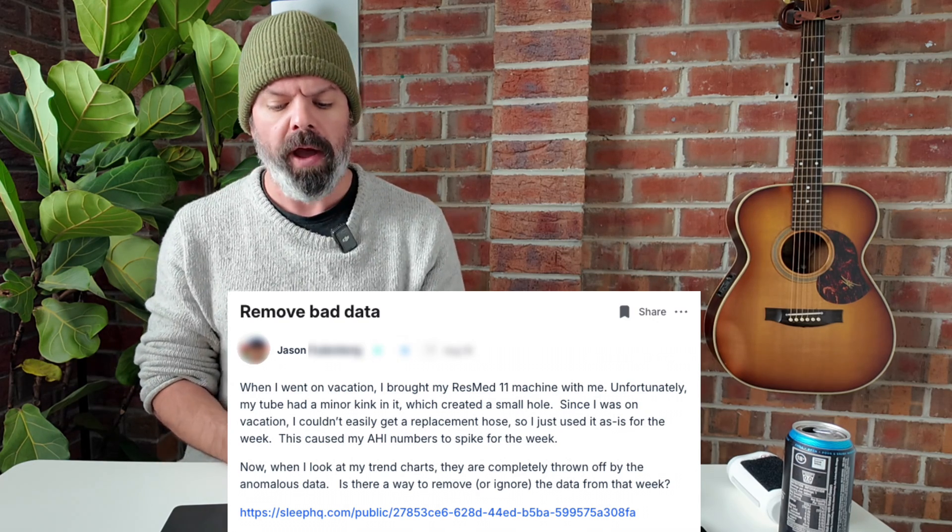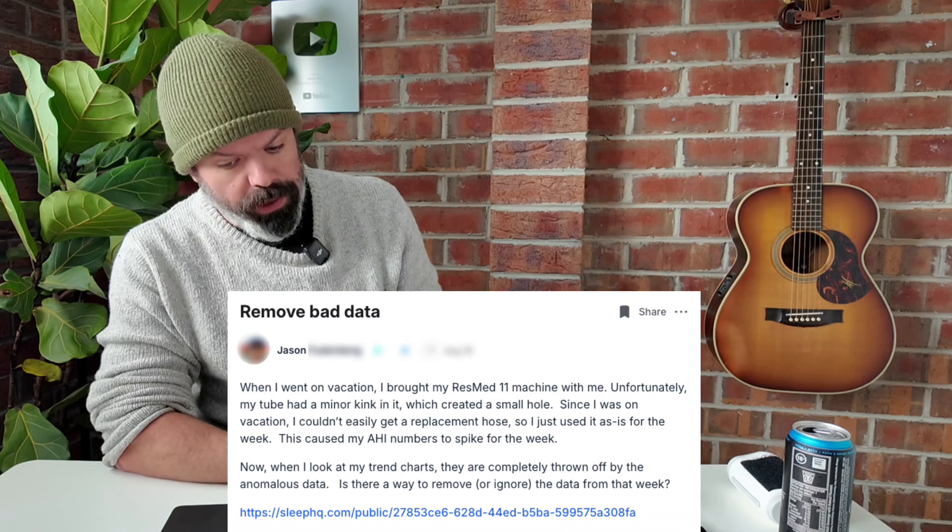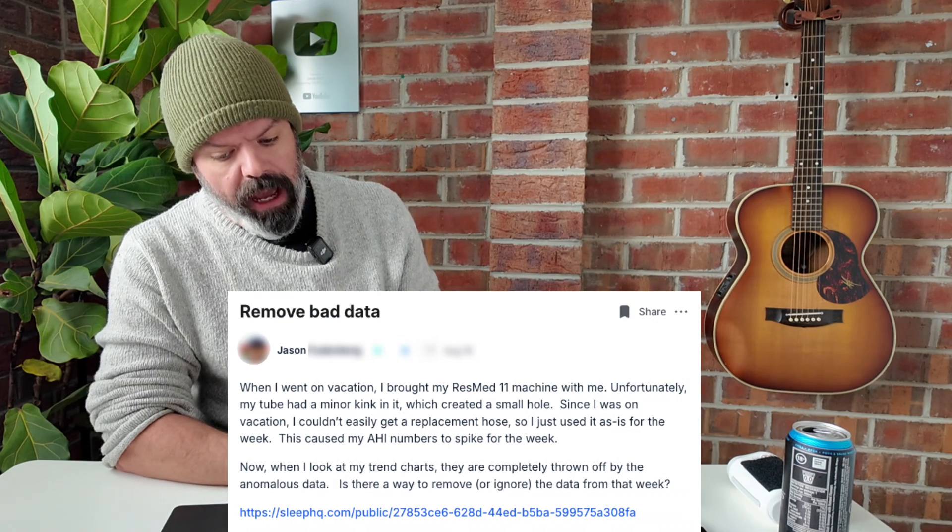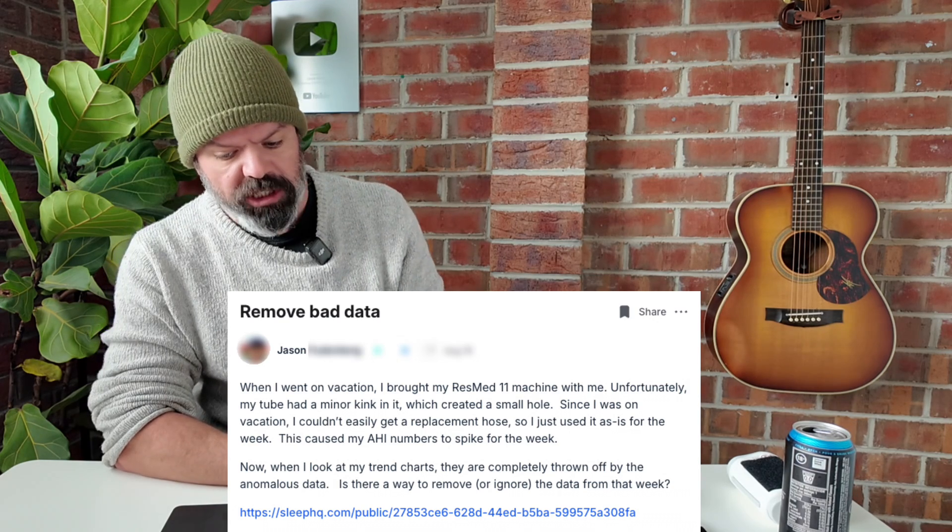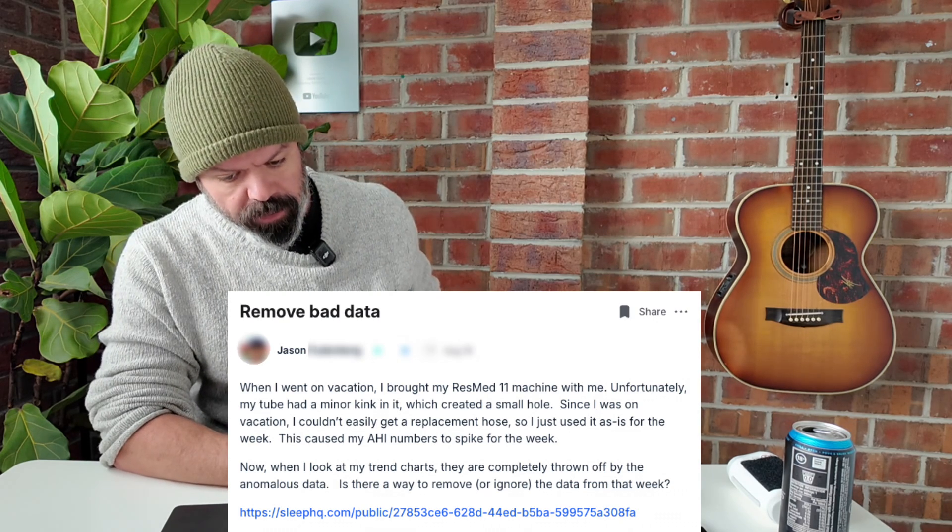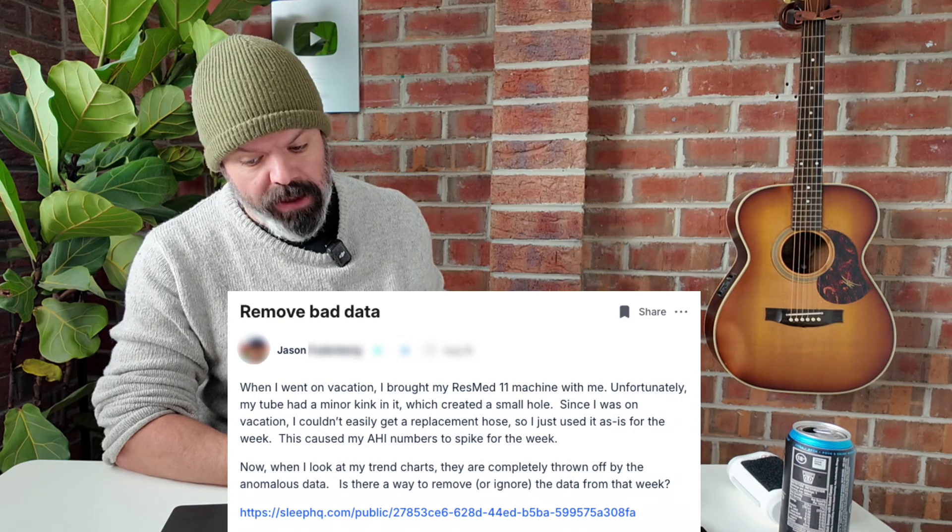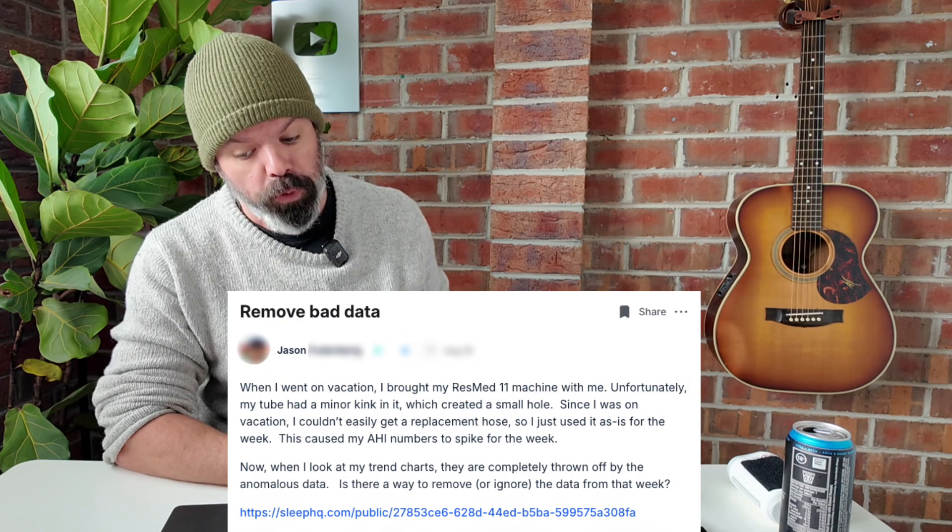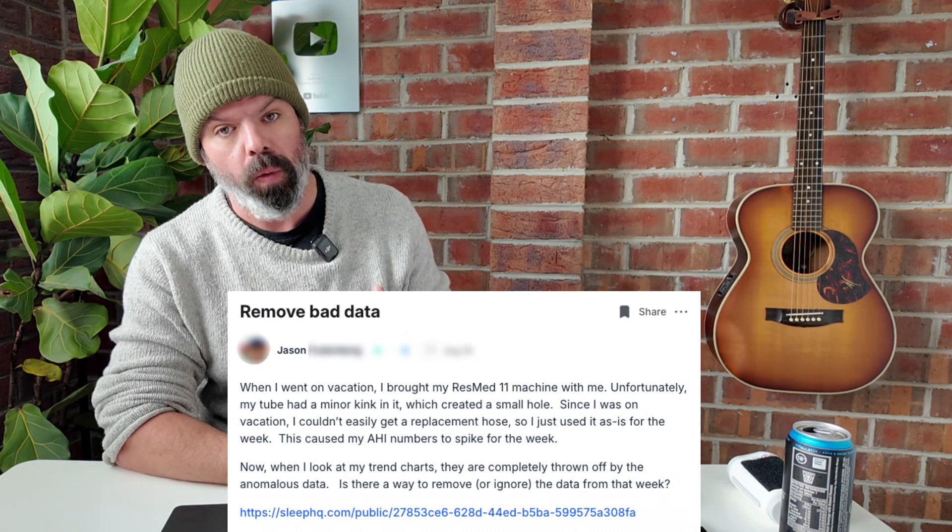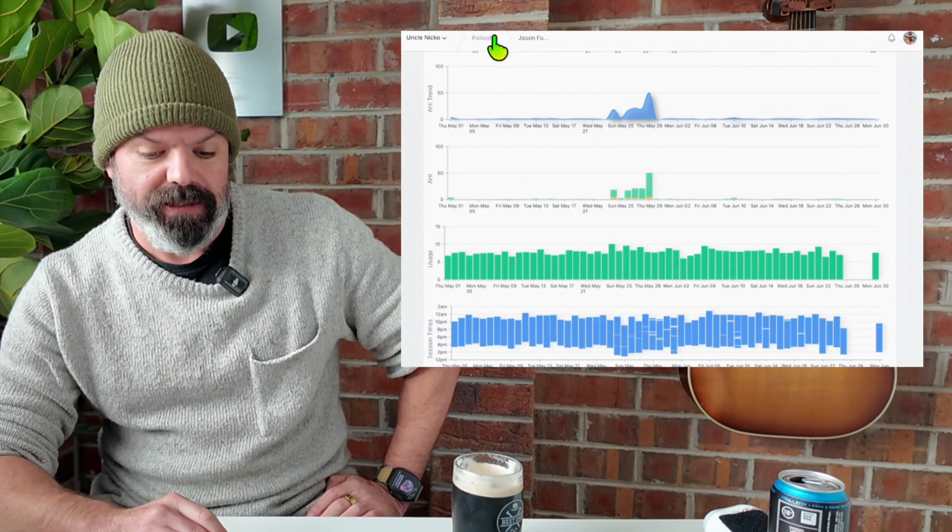This caused my AHI numbers to spike for the week. Now when I look at my trend charts, they're completely thrown off by the anomalous data. Is there a way to remove or ignore the data for that week? I was like, hmm, that's interesting. So I clicked his share link and this is what it shows. Have a look at this.